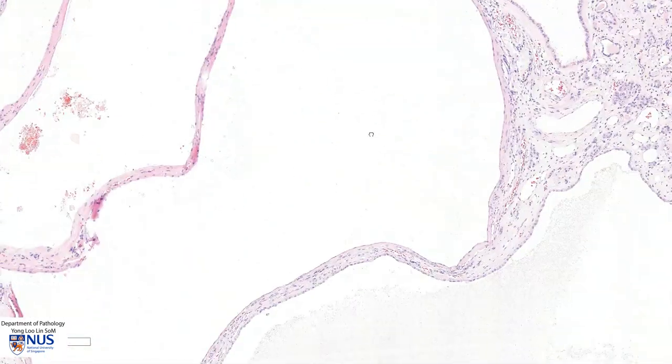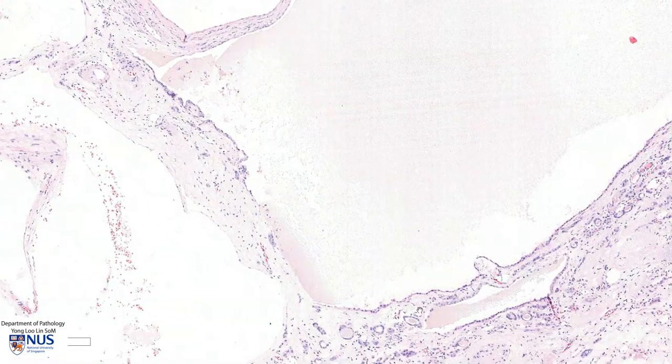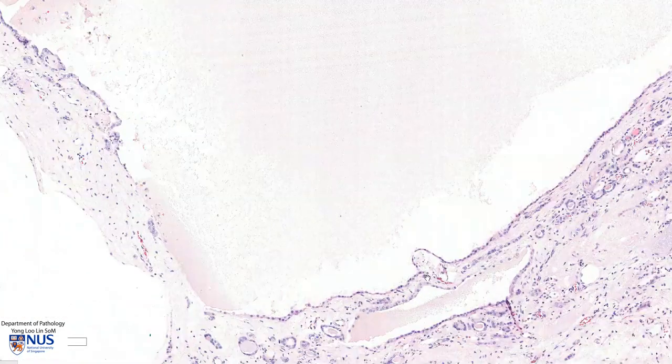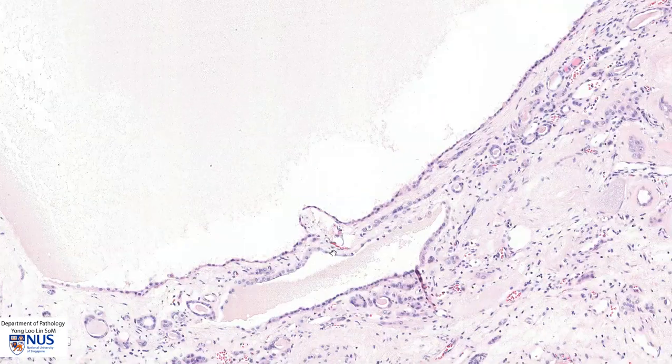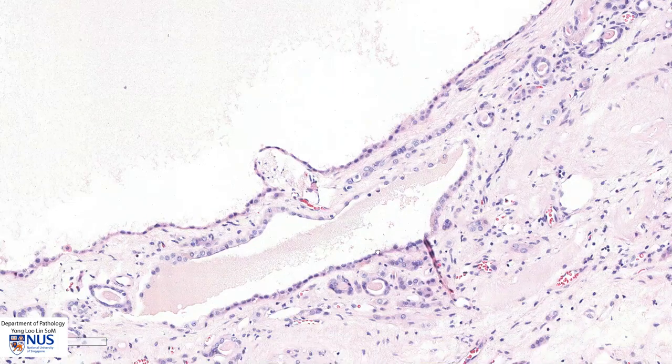Let's move around and look at a few more of these cystic structures. Again, we can see this very bland cuboidal lining epithelium.